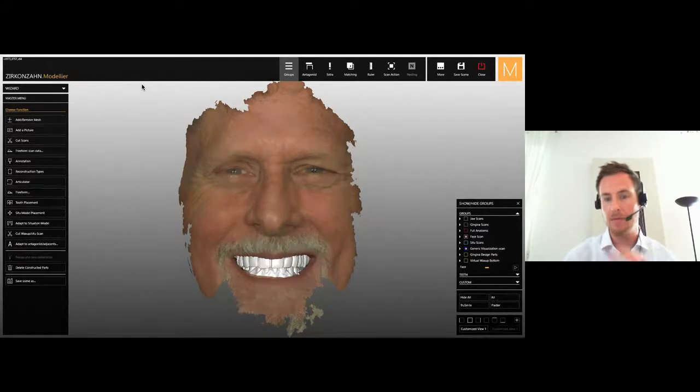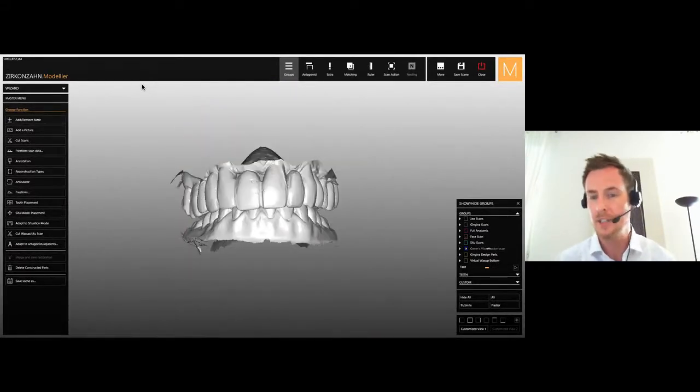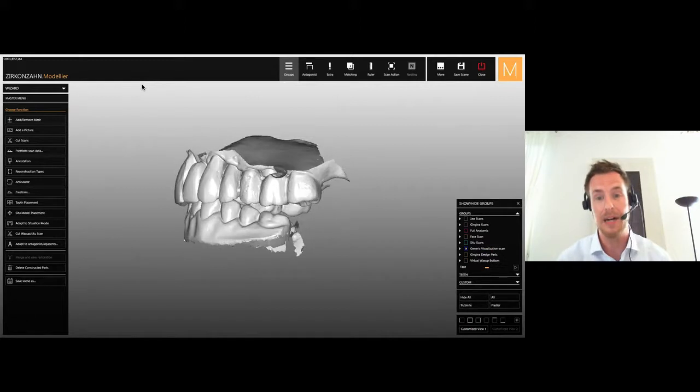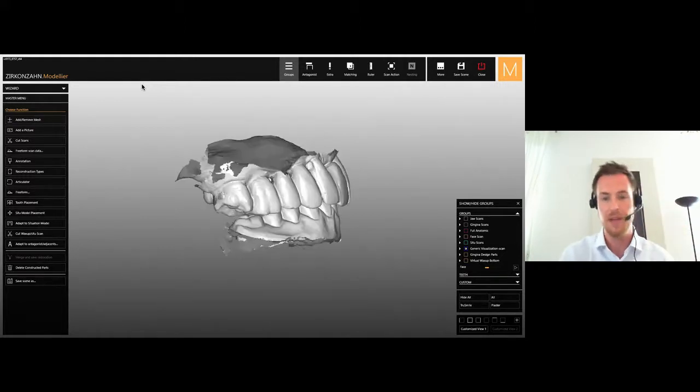I know I have to make new teeth placements, and usually as a technician, I use the pre-op situation as an orientation how to place teeth in position. But then I recognize, oh, I cannot use the situation because everything is hanging down. It's not aesthetic. The occlusion is off, and so on. I need other information, other references to make a functional and, of course, aesthetic tooth setup.